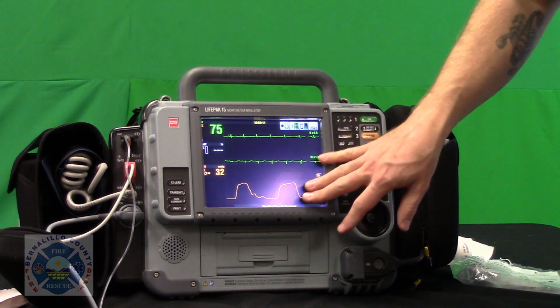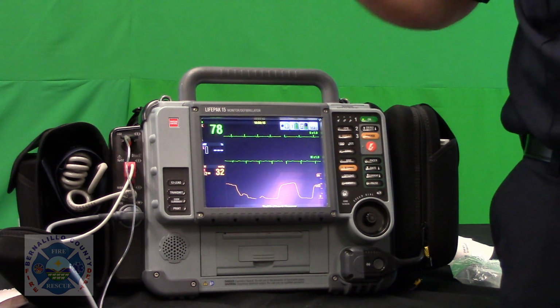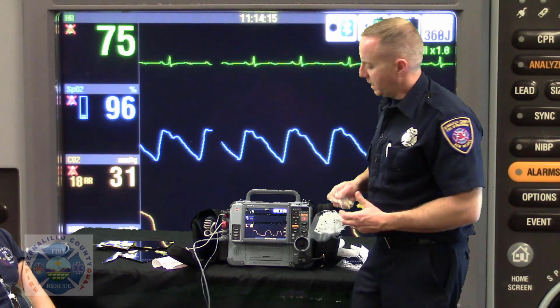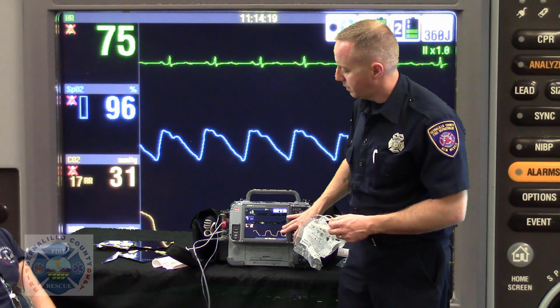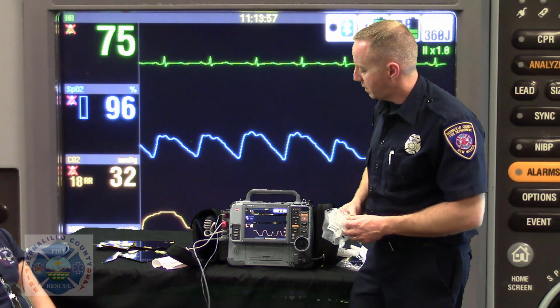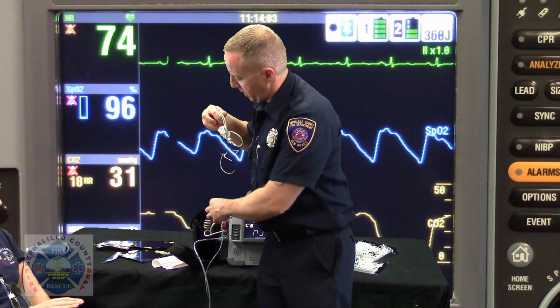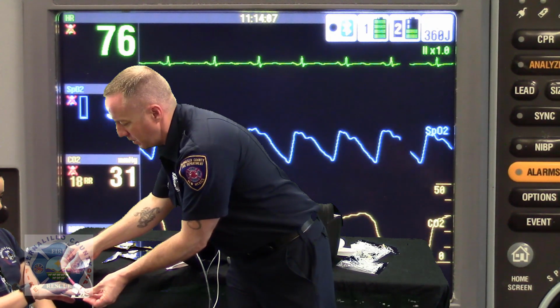But all of it is the exact same thing that you're doing, you just don't have the benefit of communicating with your patient to see if you're going in the right direction clinically. So we don't necessarily need to get into that on this discussion. This is really just familiarizing you on the clinical tool of end tidal and your LifePack. So let's just show now that we're going to put the patient back on pulse oximetry, which we've covered.